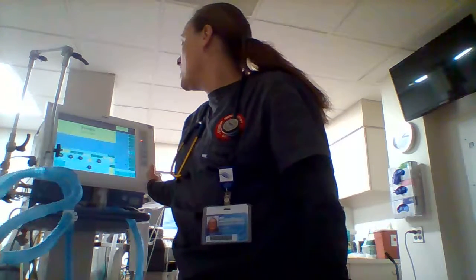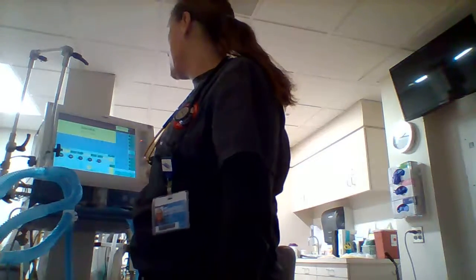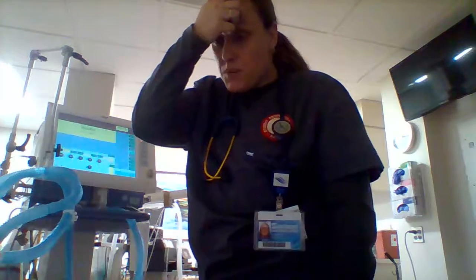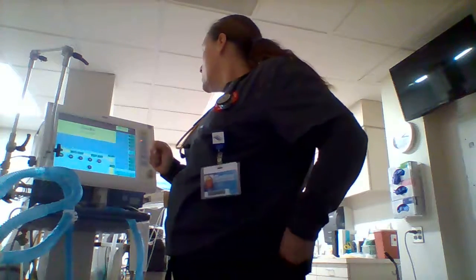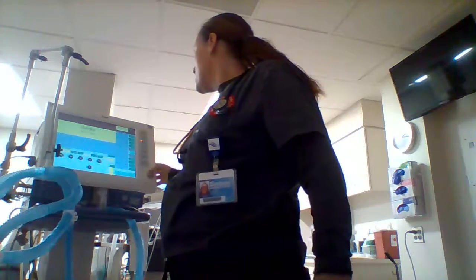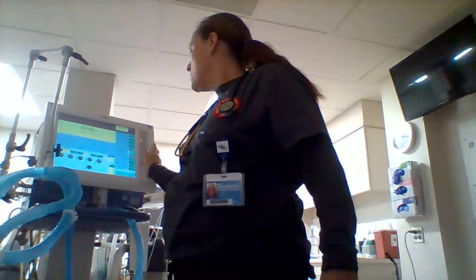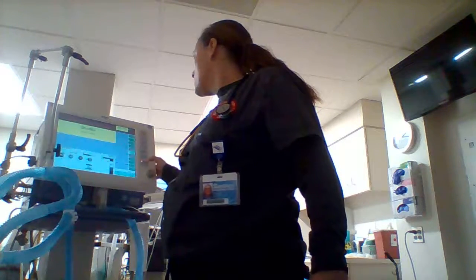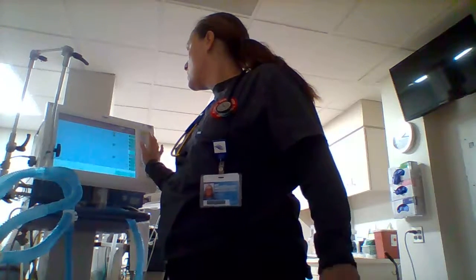Expiratory time of 2 seconds. That will work. PEEP of 5. Let's turn the PEEP way down. Let's go 0. We're going to avoid some PEEP while we can. Oh, look, I actually had that math on there. So we're going to start that. Start. Perfect.